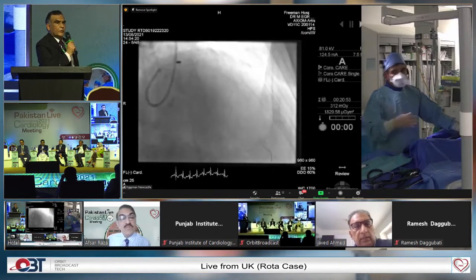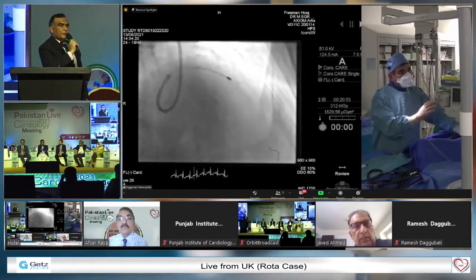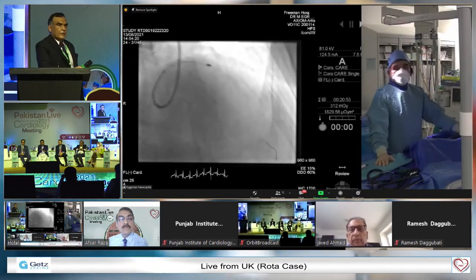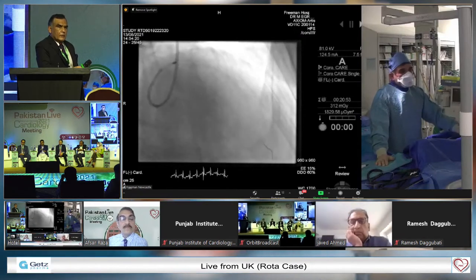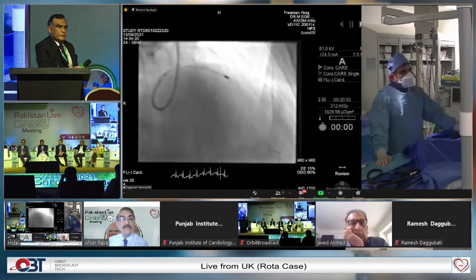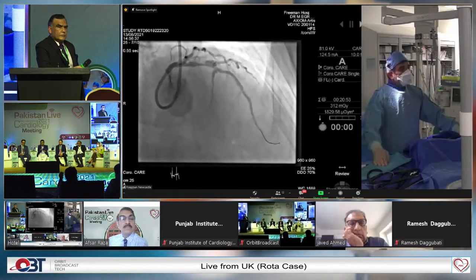Again, what you're looking for, once you've done the rotablation, you want to see the burr moving without any resistance and no drop in the rev. So the revs with the 1.75, you're using what, 140, 150 or higher or lower? 155 usually. With the 1.25, I'll use 180, 185. Anything above, I go with 150, 155. In this case, it was 155 for the 1.75 burr and 185 for the 1.25 burr. So next one. And that's the result after the rotablation with the 1.75. Next.